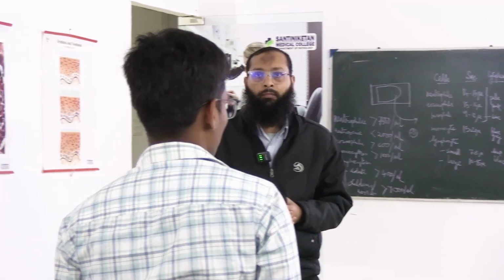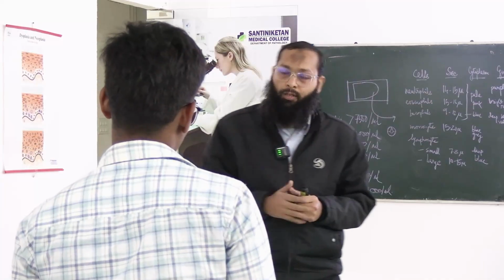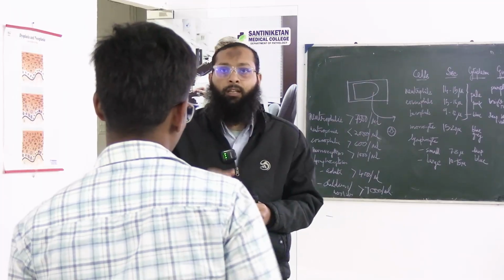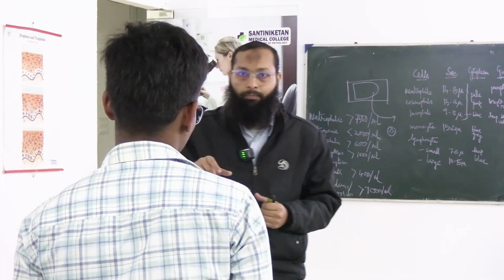Then the other slide, which is a spreader, you put it where? In front of the blood drop. Then moved back. First you touched it with that blood drop.